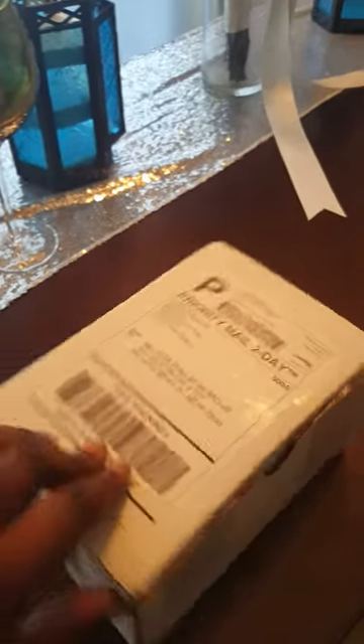Really good packaging and this came super fast. Today is Friday, I ordered this on Monday and it's already here. It came from, I think, Colorado and I'm in Montgomery, Alabama right now.